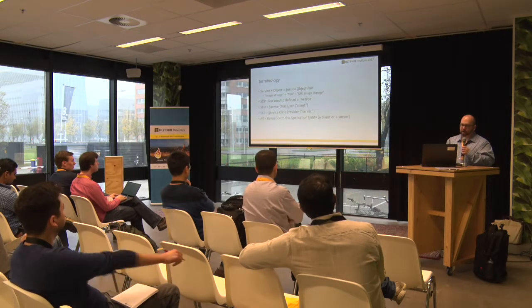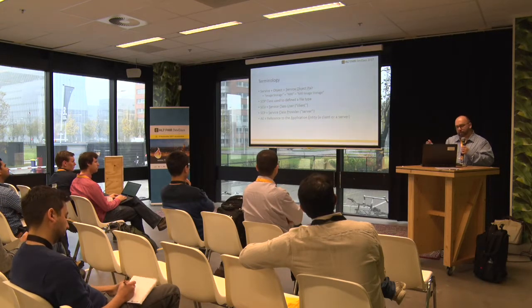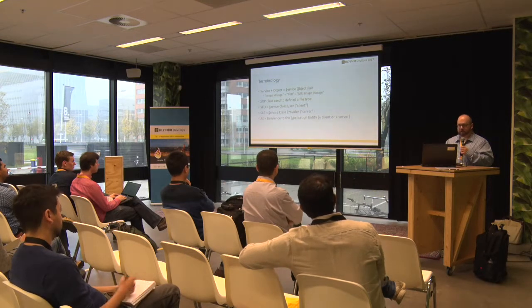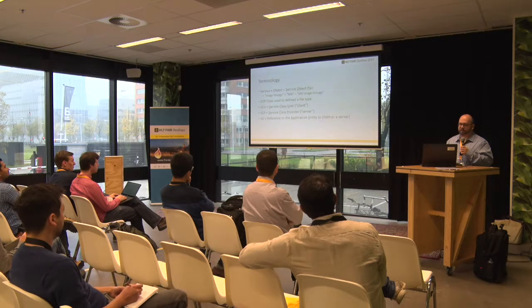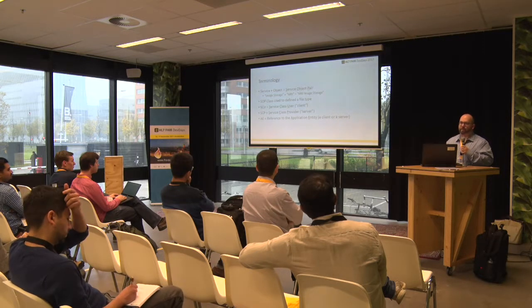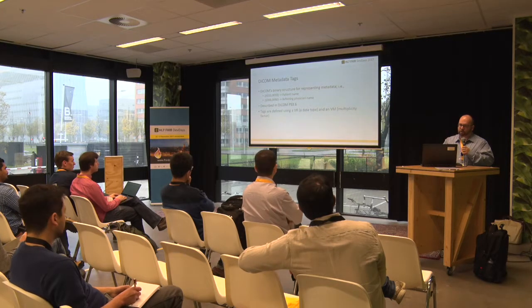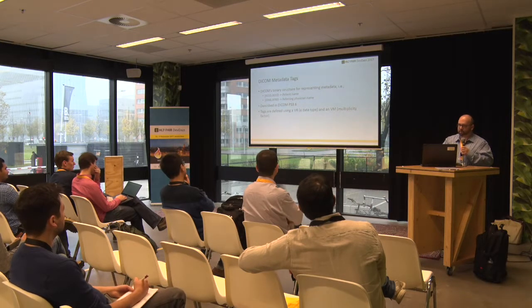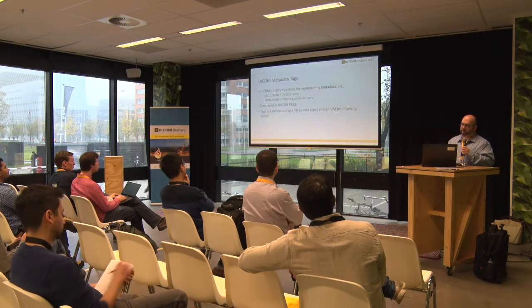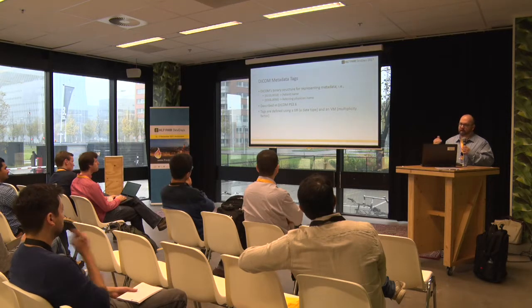If you think about servers and clients, DICOM transcended that even before, around the time of HTTP. So we have things like service object pairs, service class users, service class providers, which you can think about as clients and servers. We join these things together, a service plus an object, and it talks about a service that's being offered. As I mentioned, DICOM uses metadata tags. They use hexadecimal values, so 0010,0010 is the patient name, 0008,0090 is the referring physician name, and it's all defined in part 6 of the DICOM standard. We use VR and VM to talk about the data type and the cardinality as well.